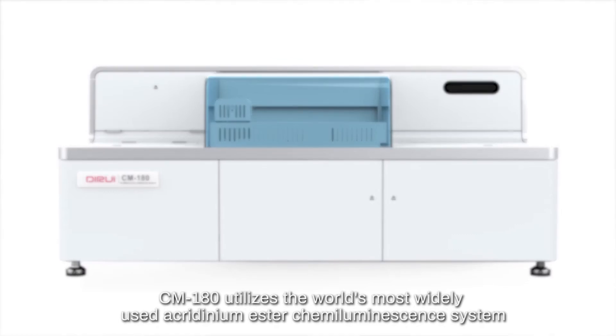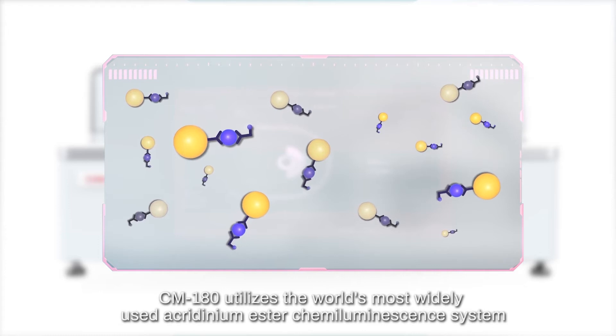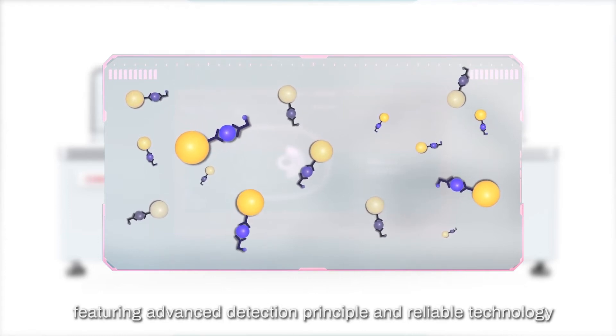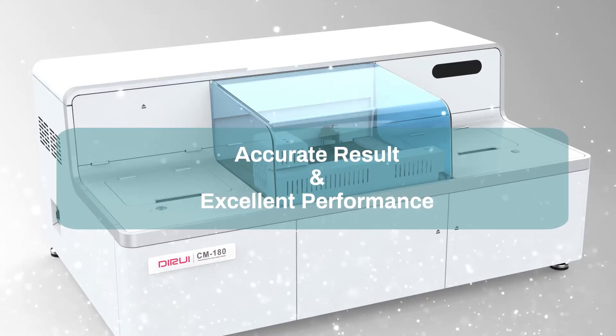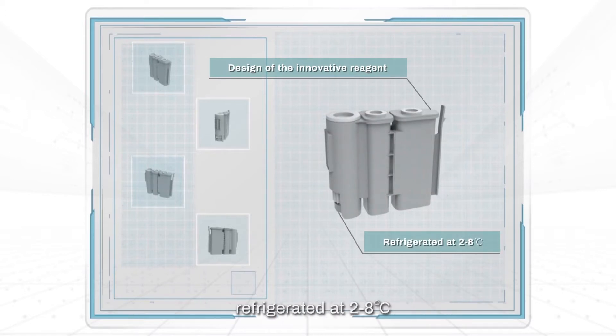CM180 utilizes the world's most widely used acridinium ester chemiluminescence system, featuring an advanced detection principle and reliable technology. The unique anti-volatility design of the innovative reagent disk and kits, refrigerated at 2 to 8 degrees centigrade, ensures stability and homogeneity of reagents.